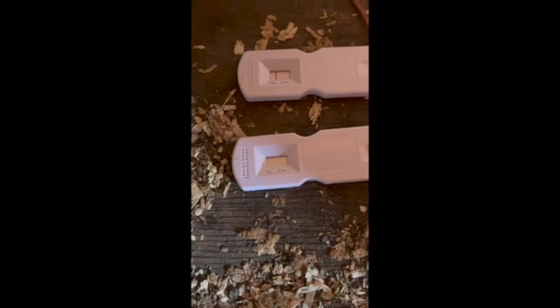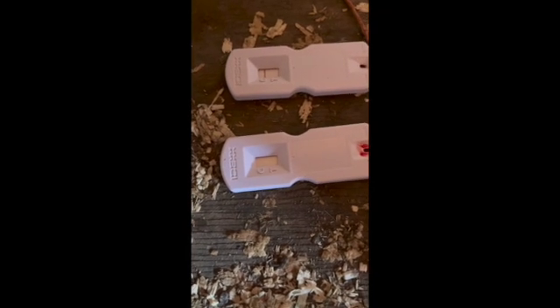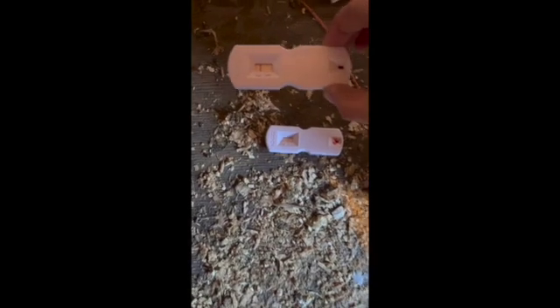We're getting close to 20 minutes for that first one — it's 18 minutes — and it's a fairly clear negative. I like to hold it up in the light, a little trick from human pregnancy tests, because any sort of faint line indicates positive. I don't see any sort of line.